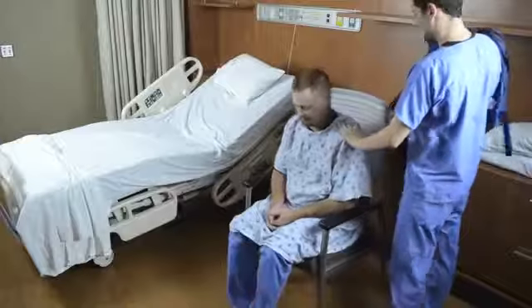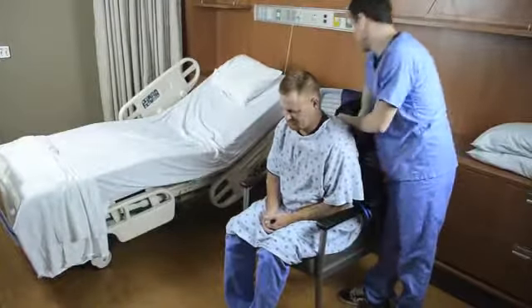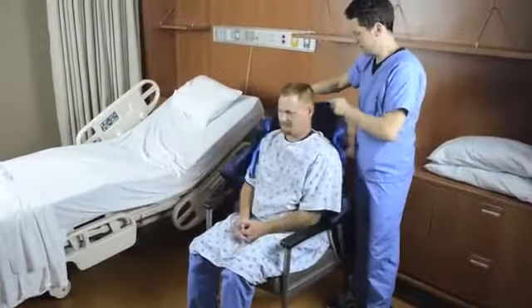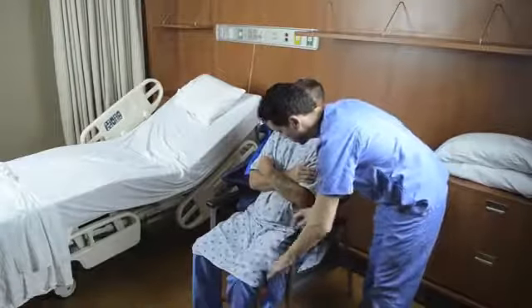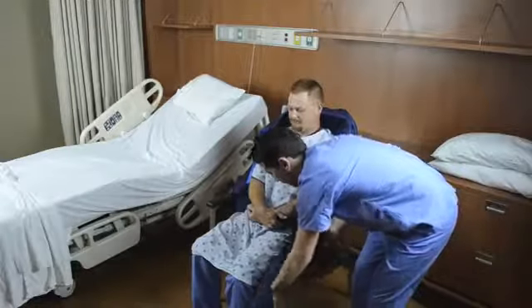Transferring patient from chair to bed with the OptiPo sling. To place the sling, instruct the patient to lean forward. Tuck the sling down the patient's back to the coccyx area. Once in place, instruct the patient to lean back onto the sling, holding it against the chair.